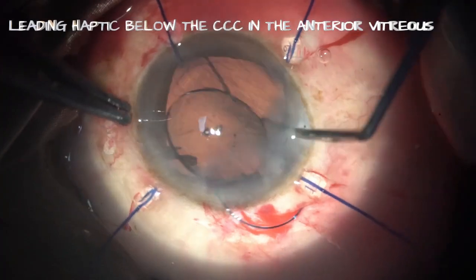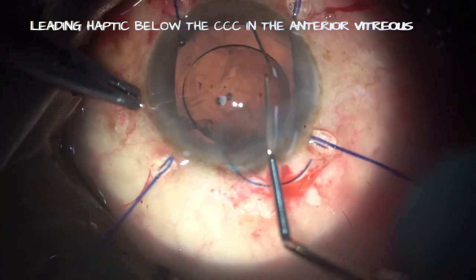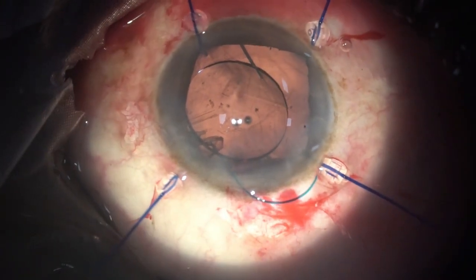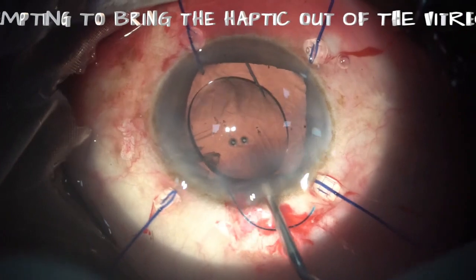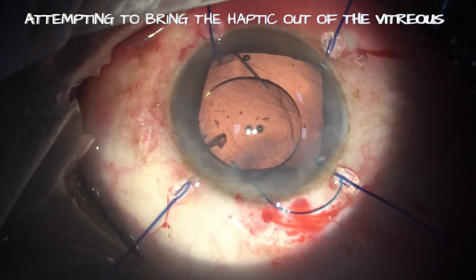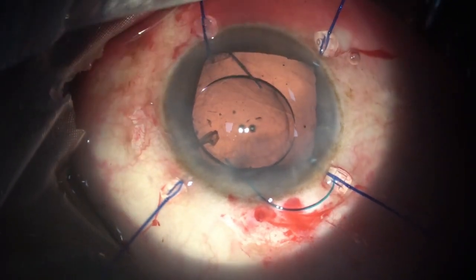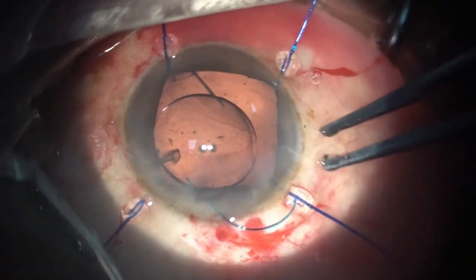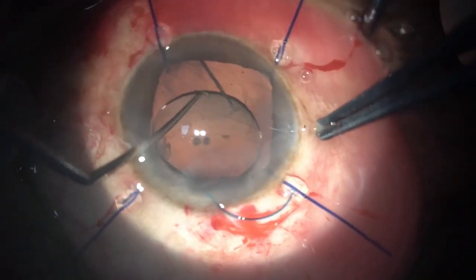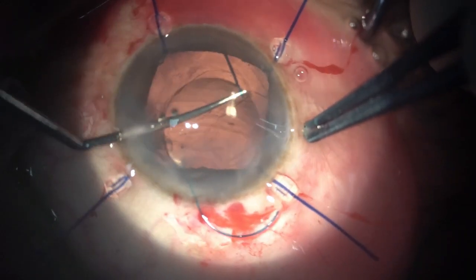As you can see, the surgeon is unable to keep the leading haptic in the anterior chamber. The surgeon had 2 to 3 failed attempts to bring the leading haptic out of the vitreous.